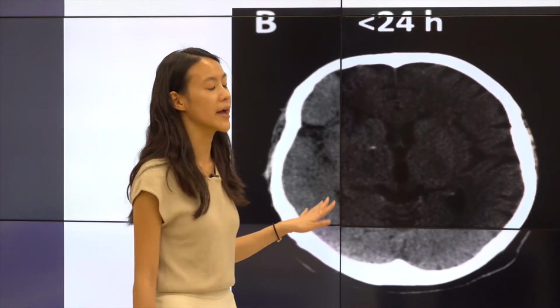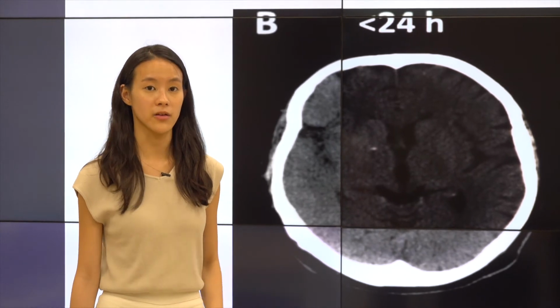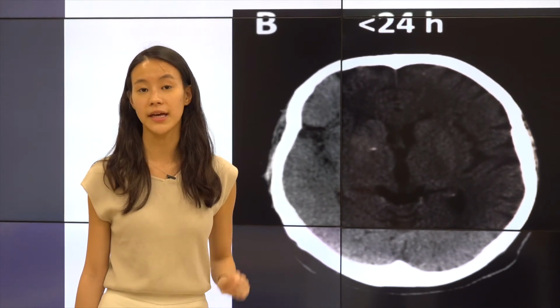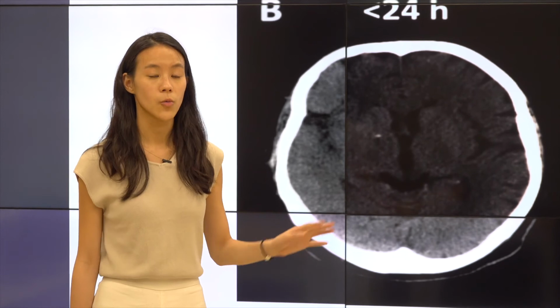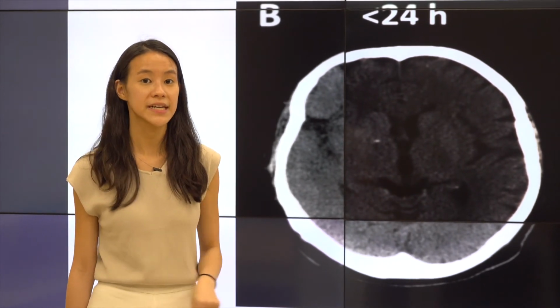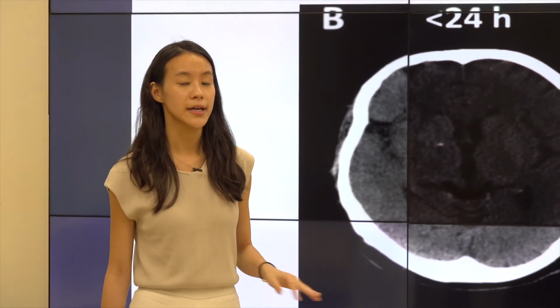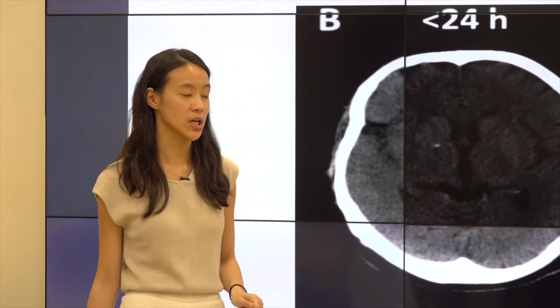This is why it's so important for the computer to come in, where they have a set algorithm or a set of rules. You can think of it as a number of steps that they go through that becomes more standardized for these images to become more registered. So the computer can help us decide on everything together.